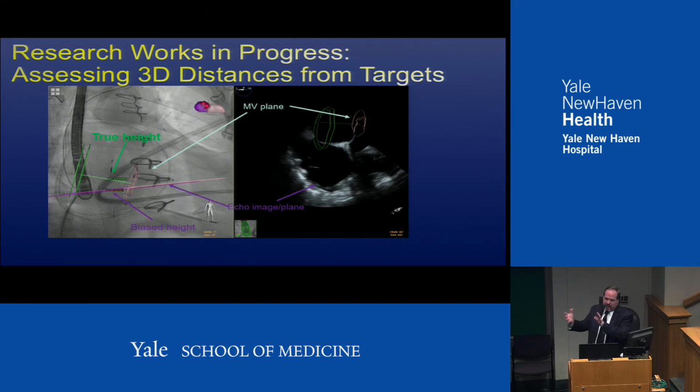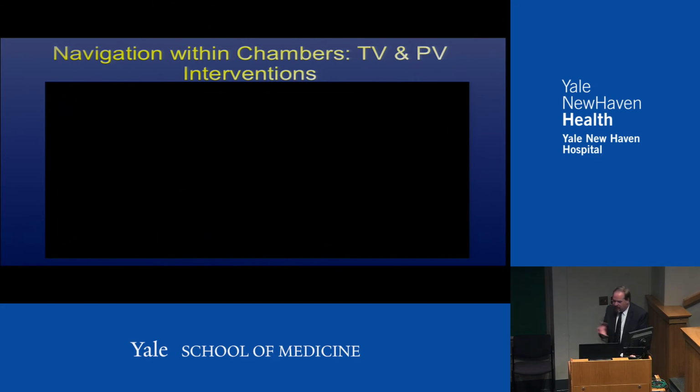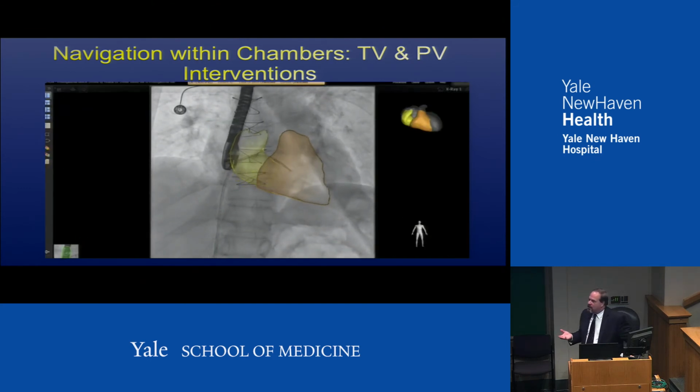So as you move this in an RAO ventriculogram or whatever, you can actually see these lines, and when you want to do the transseptal puncture for a mitral procedure, you're within those lines. It's the correct zone. And so you can use all these tools in 3D once you have it segmented out to help you in doing the procedures. This just shows the volumetric technique in which you could do a right heart catheterization, in which you put it across the tricuspid valve and ultimately out the pulmonic valve, doing the model system.